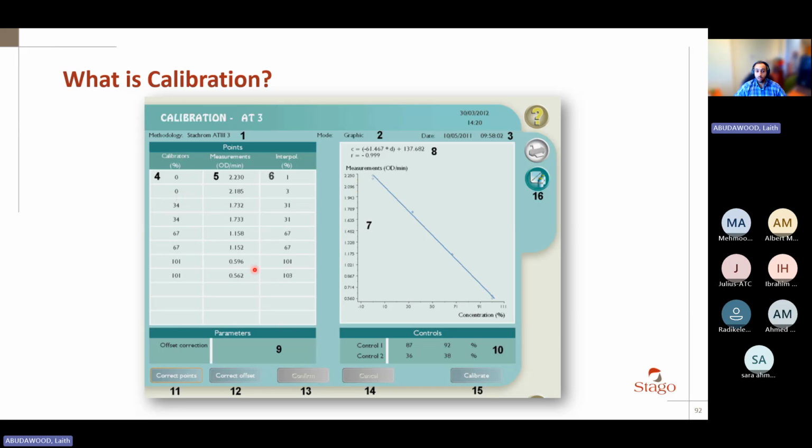Maybe the machine actually has a very significant bias, but on this single concentration it reads perfectly well. You never know. Maybe at lower concentrations, it reads horrible results. That's why often we do calibration on multiple points, so that we detect whether we have a problem with lower or high concentrations. Because this can happen.